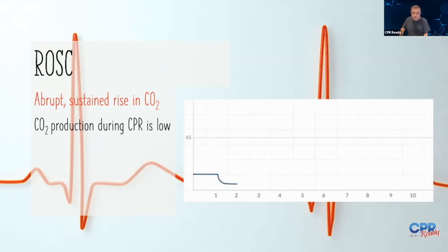They've regained a pulse. So end tidal CO2 monitoring while you're working that resuscitation can clue you in that you've been successful, and this can signal an opportunity to go ahead and check a pulse. Now, it depends on your local protocols. If you complete your 2-minute cycle when you see this, or if you stop right away and check for a pulse, that'll depend system to system. But this is a good indicator if you see a sustained rise.